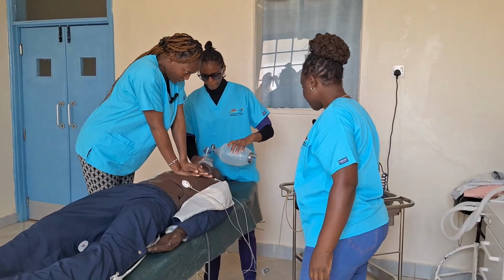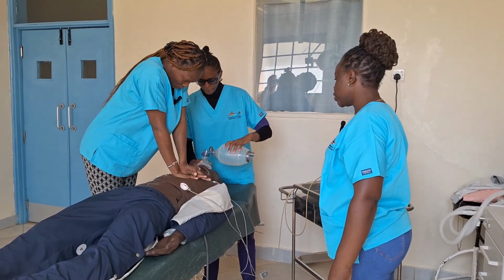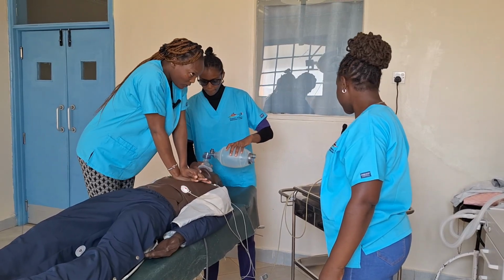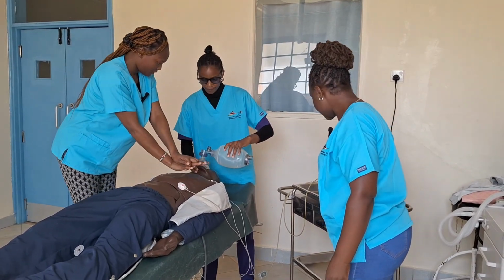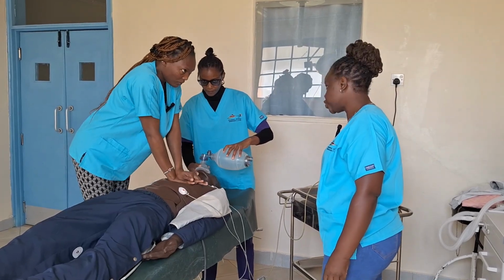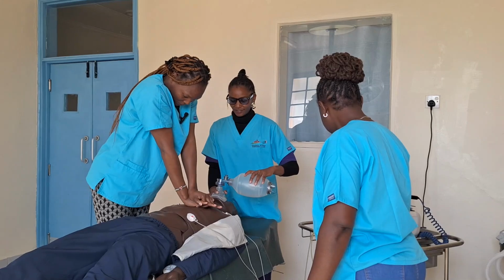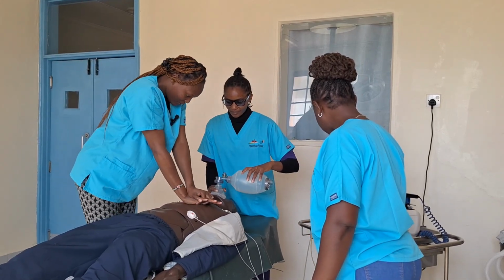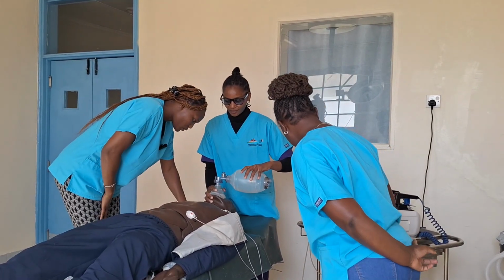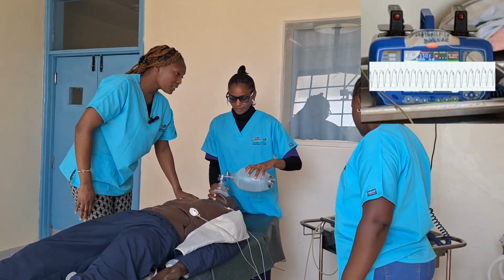Jackie, at some point I'll tell you to take a pause from giving chest compressions. You are going to check for the pulse of the patient. At the same time, I'm going to check for the rhythm. When I tell you to resume, you resume immediately. Are we okay? Okay. Jackie, can you please check for a pulse? I'm looking for the rhythm. I have a shockable rhythm. Do we have a pulse? No pulse.